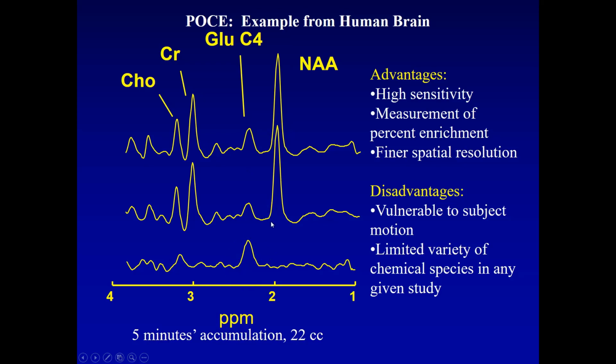The N-acetyl aspartate turns over very slowly during the C13 glucose infusions. So N-acetyl aspartate has basically no labeling in it, and it subtracts to 0. The 1% is too small to detect in this short time and this small volume. Creatine and choline also.